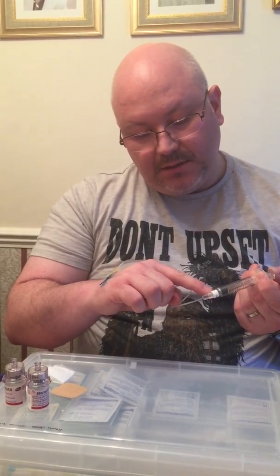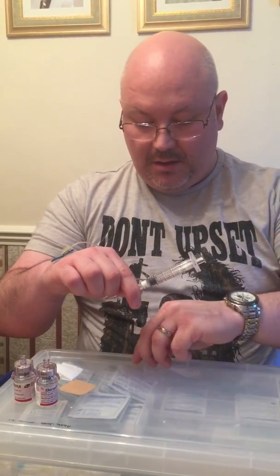I can hold on to that and pop the first syringe into the sharps box — that's going to be burnt later at the hospital. Continue to infuse. Now, if you remember the cap for the butterfly needle, I didn't throw it in the sharps box — it's still here because I'm going to be using it in a minute. Because when I pull the needle out I've only got two hands, not three. So to make it more manageable, once I get to the end of the clotting factor I unscrew the syringe and pop the cap back on. That stops the blood flowing out and makes it much more manageable to remove the needle.